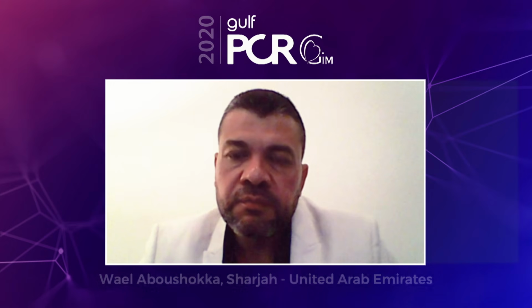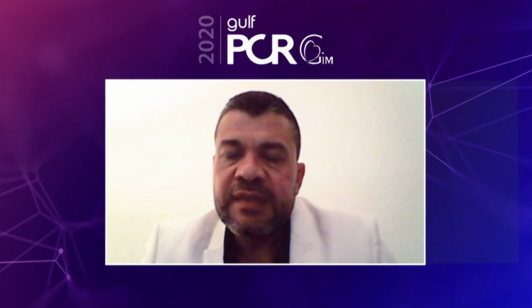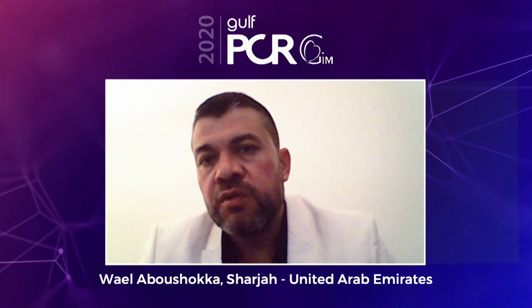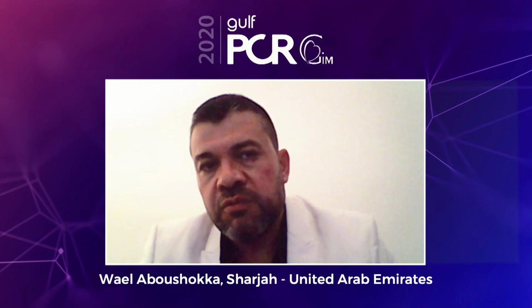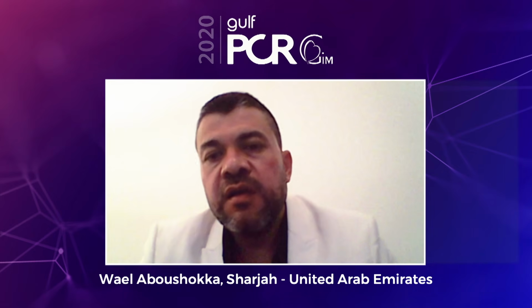If you do allow me to focus a little bit on the calcified lesion characteristics, are there dedicated characteristics where you prefer the orbital atherectomy device over the rotablator? Usually, in ostial lesions, I would prefer it because of its dual way of working. You can use it backward when pulling back the device to treat ostial left main or ostial RCA.